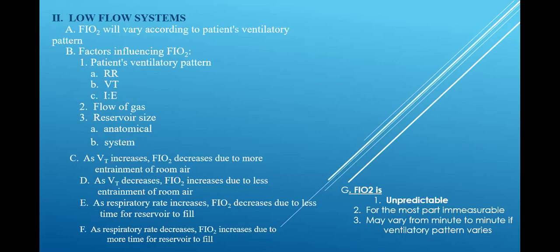Just like Kool-Aid. If I pour a whole pack of powder Kool-Aid into 2 drops of water, the concentration is going to be extreme. But if I put 2 gallons of water on it, now I can barely taste the Kool-Aid. So when I increase the outside flow, which is called air entrainment, here goes that word, they're saying as the tidal volume increases, the FiO2 has to decrease due to more entrainment of room air. What percent of oxygen is room air?